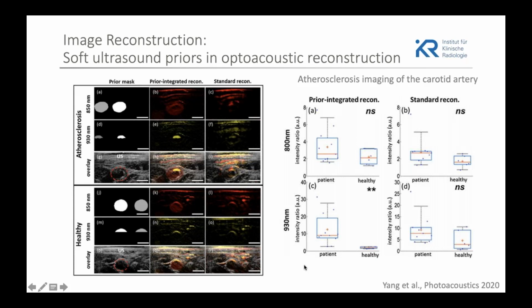So this might be a topic to further address. There are many others regarding the handheld probe itself and the spectral unmixing, but also, and this I would like to show you with this paper, there can be some advantage of using ultrasound and optoacoustic imaging at the same time.